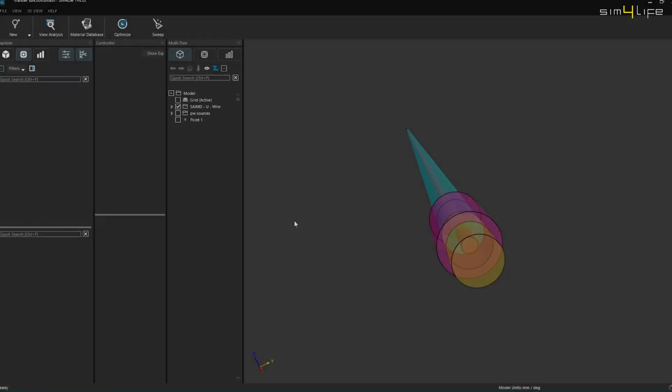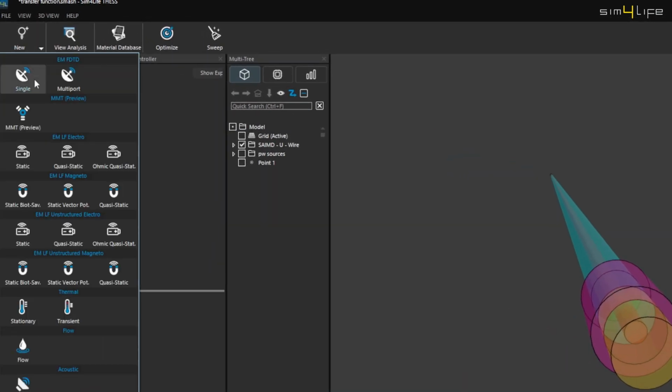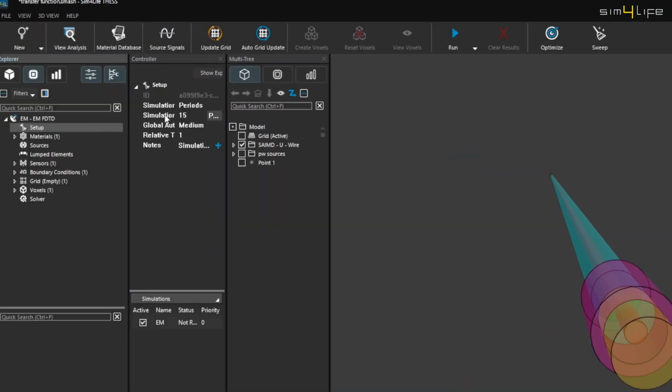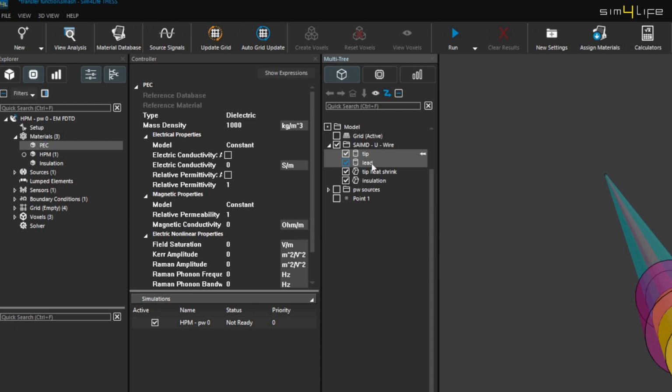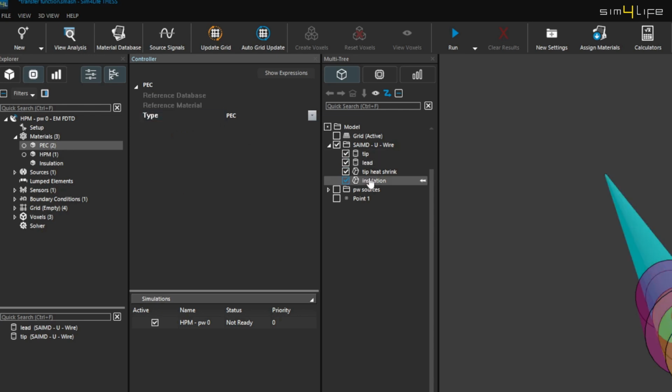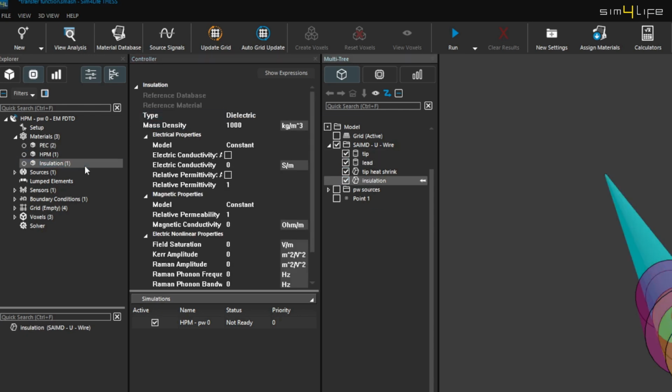We begin by creating a single-port FDTD simulation with a runtime of 12 periods. This duration ensures that the electromagnetic fields have sufficient time to fully evolve and reach convergence. Next, we head to the Materials section to create the material settings for the implant lead and tip, which will be modeled as perfect electrical conductors. The lead insulation will be defined as a dielectric material with a relative permittivity of 3.